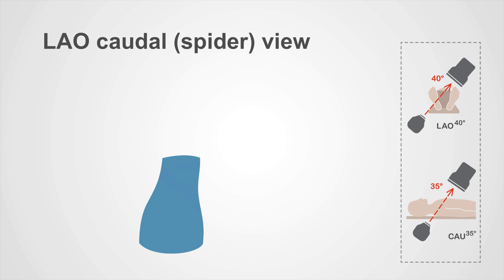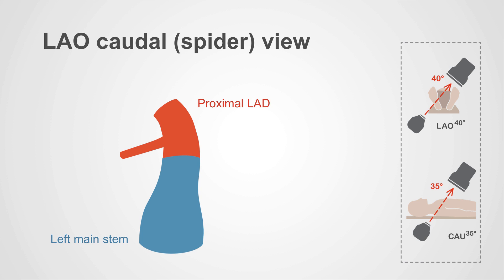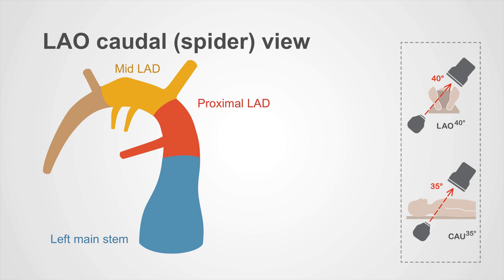Here's the left main stem coming off the aorta. You can see that it branches first to form the proximal LAD, which continues to form the mid-LAD and then the distal LAD. In the spider view, the LAD goes off to the left-hand side of the screen.